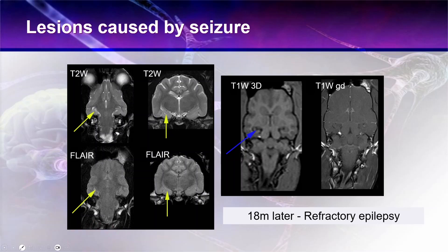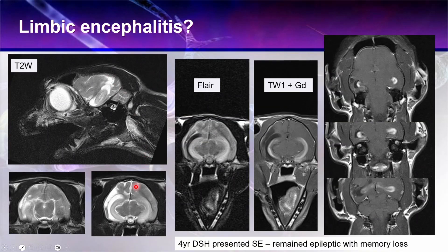Here we have another example. This cat is not actually known — it's uncertain what was going on. It has a few changes we wouldn't expect with straightforward limbic encephalitis because it has other cortical involvement. But there is very definite involvement of the mesiotemporal lobe here. There is also this area which is a complete whiteout. So what is going on — is it completely necrotic or is it inflammatory?